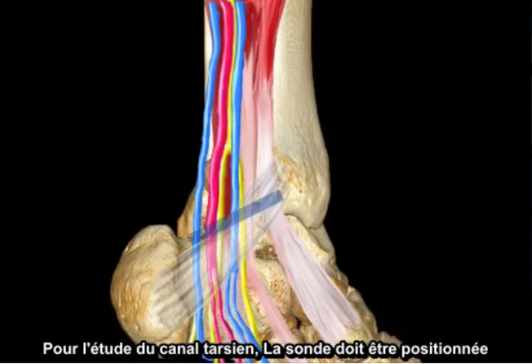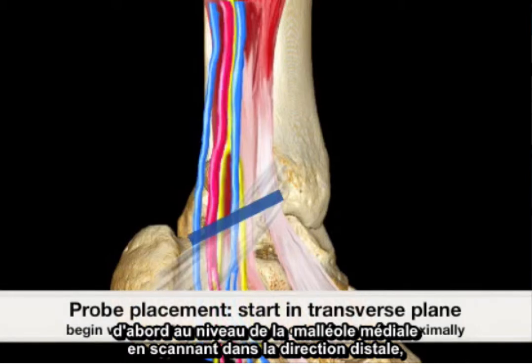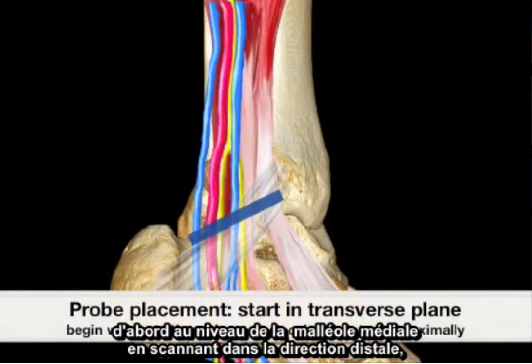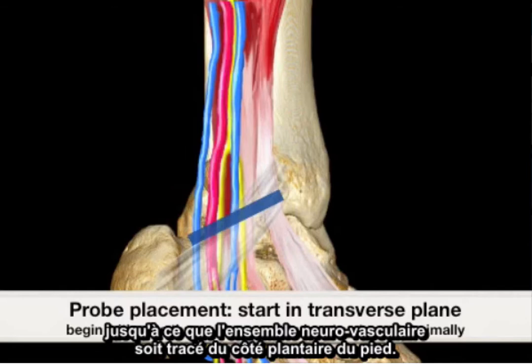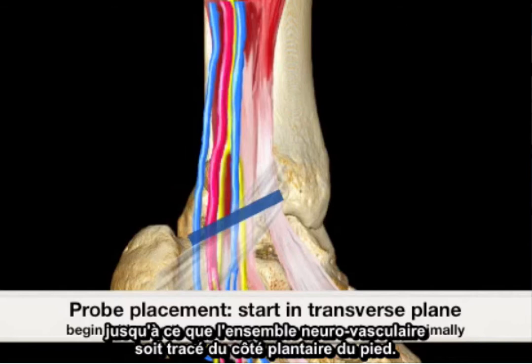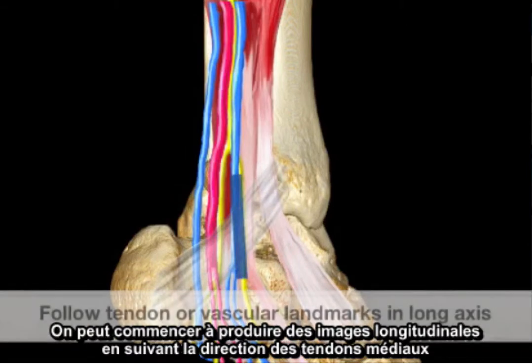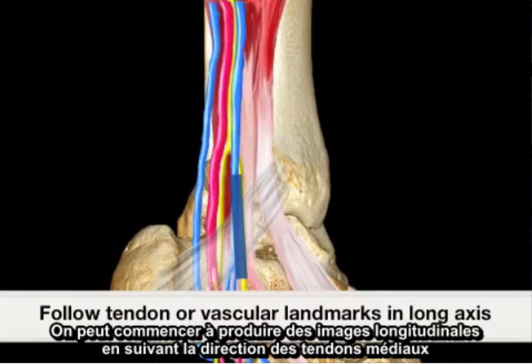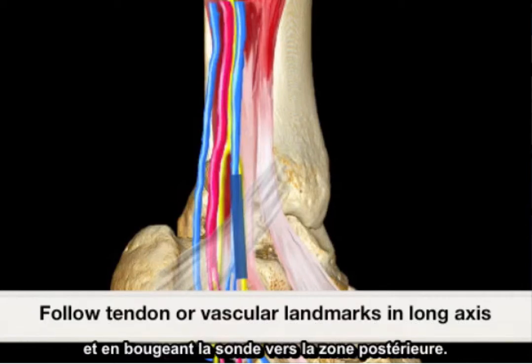Probe position for the tarsal tunnel study should begin at the level of the medial malleolus and scanning distally until this neurovascular bundle is traced to the plantar aspect of the foot. Long axis images can begin by following the direction of the medial tendons and moving the probe posteriorly.